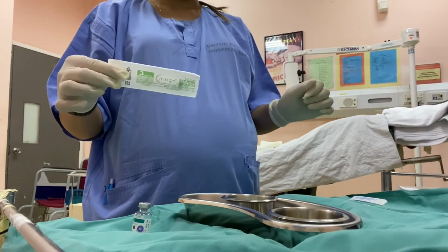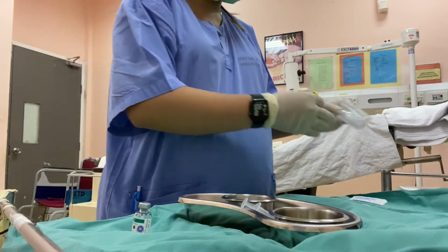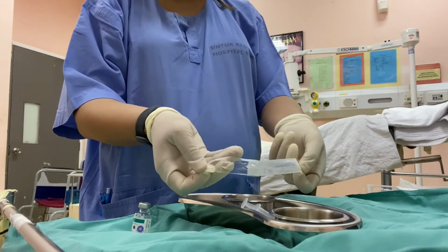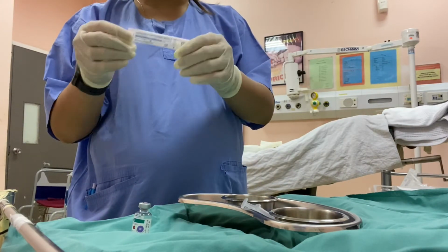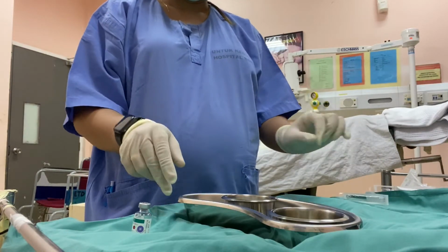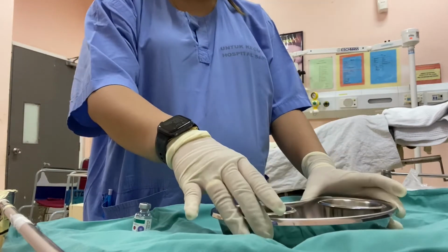These are the syringes we open and put inside this kidney dish, the 23G size of needle, and the 22G size of needle. This is how our tray set looks.